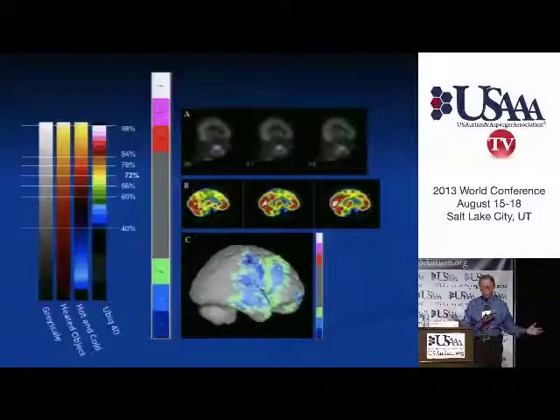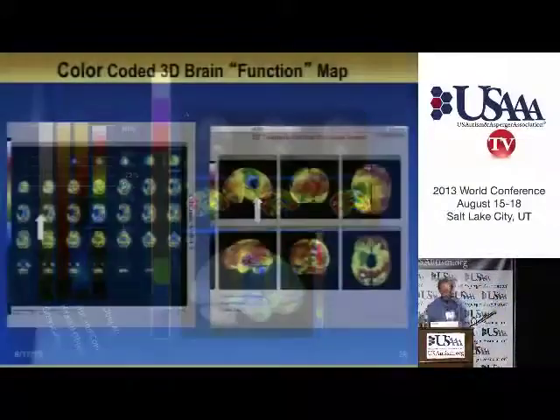I know some of you get SPECT scans on individuals. They're sent to me and Dr. Henderson. And sometimes they're just scaled in some color scale that doesn't necessarily have any physiologic meaning. No wonder people have some trouble interpreting these scans.